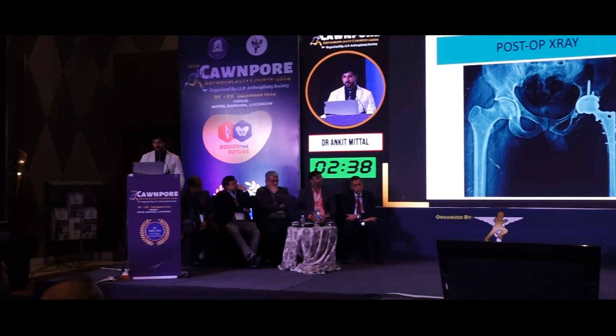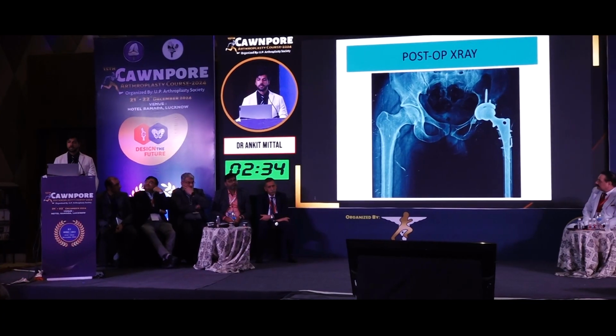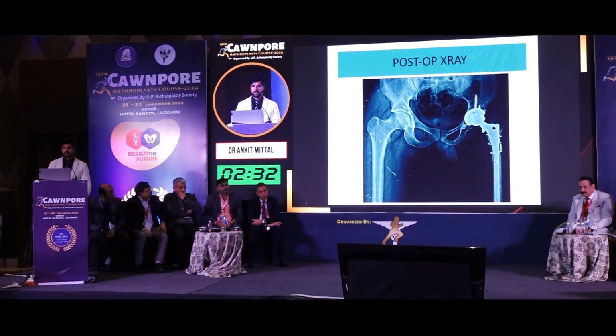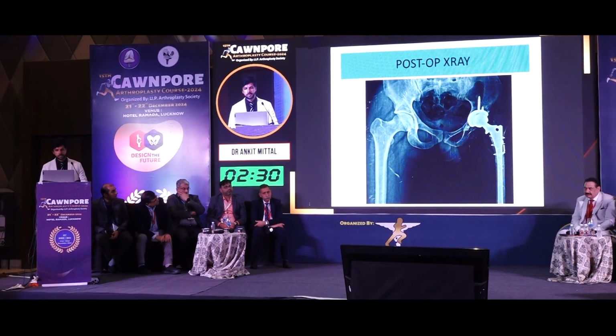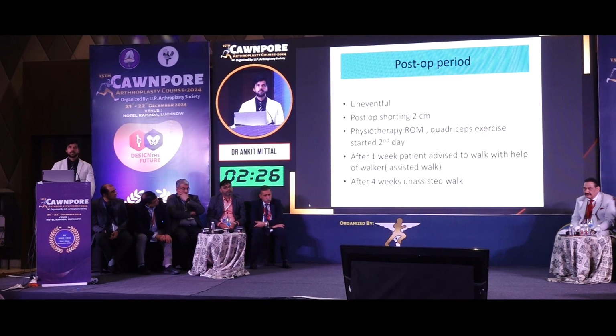This was the post-operative X-ray of the patient. We did tension band wiring, cerclage wiring of the femur to prevent any intraoperative fracture while putting the stem. And we didn't have to do subtrochanteric osteotomy in this case. The post-operative period was uneventful.